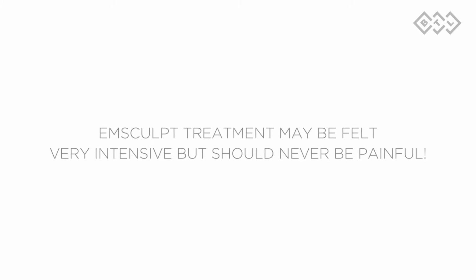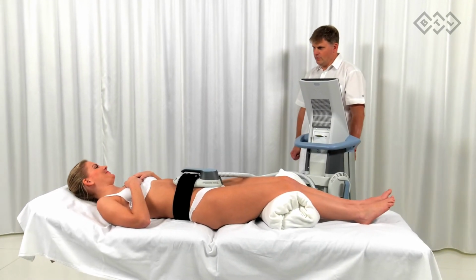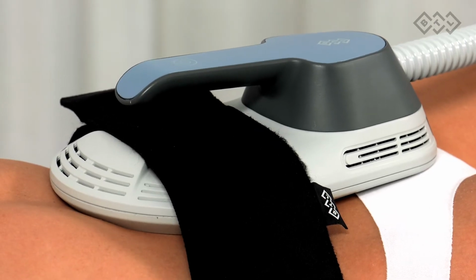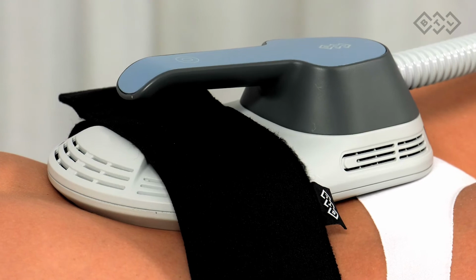Emsculpt treatment may feel very intensive, but should never be painful. A strong muscle response is essential to maximizing treatment results. However, patient comfort should never be compromised. Make sure that you maintain the treatment settings just below the patient's maximal tolerance threshold.